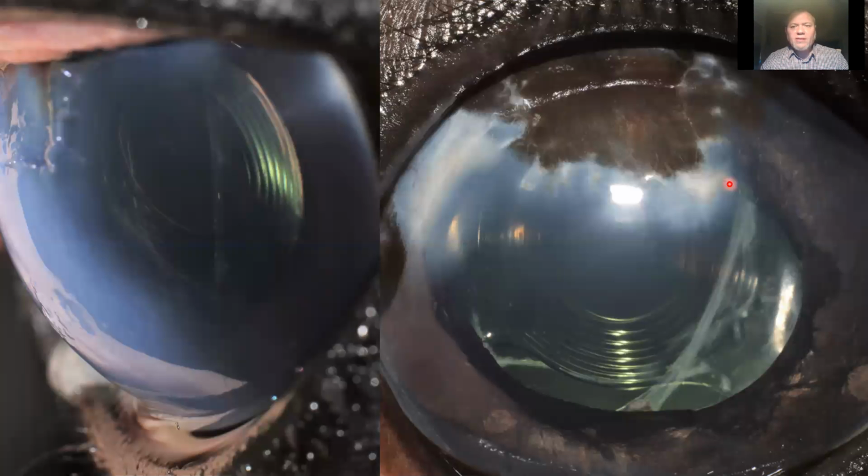This is another similar case, actually. This is another lens perforation of blackthorn. And again, lighting in different ways, you can actually see the lens capsule tear, the artificial lens in the bag, and the cornea itself. And by changing angle, we can get information about the corneal curvature. This is a before and after shot. The left-hand one is not long after surgery, where the corneal transplant is still fresh, and this is now several weeks down the line, where the cornea has become nicely integrated.